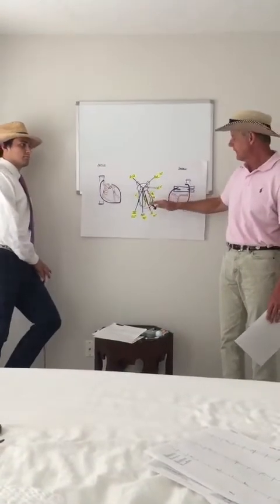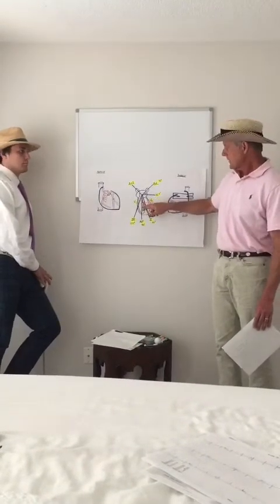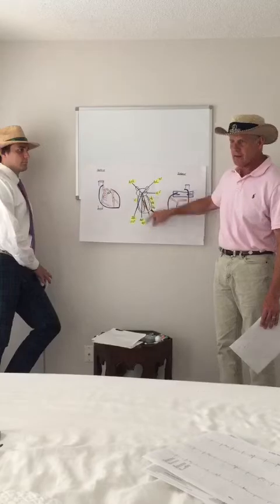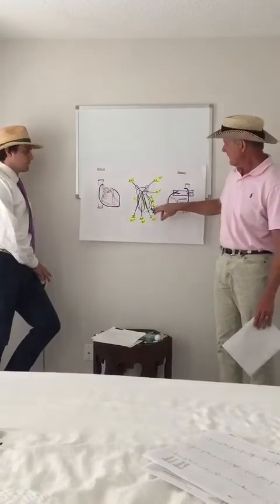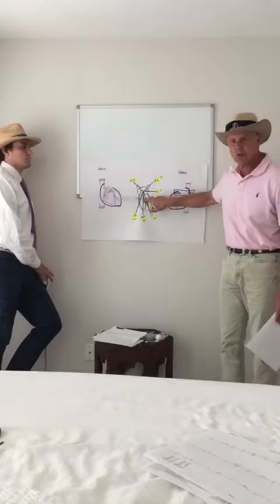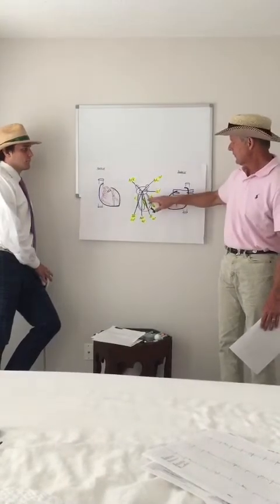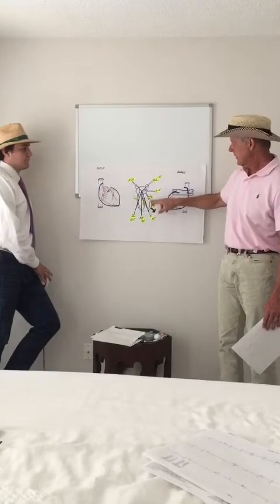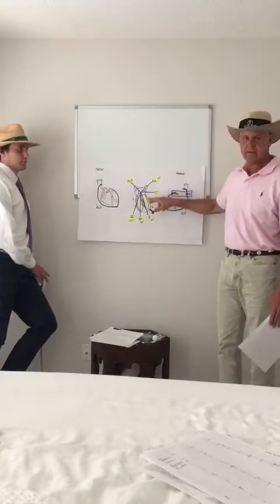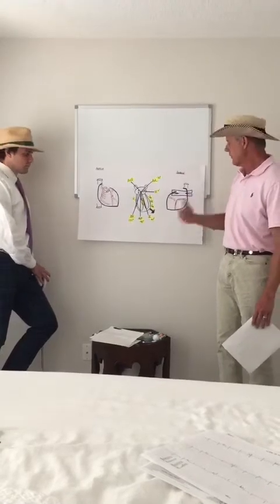We always add the prefix antero when we're talking about the V leads or the chest leads. So when he showed you the EKG with the coved upward convex ST elevation in leads V2 and V3, you knew the patient was having an anteroseptal infarct. If he had an EKG that showed acute ST segment elevation in V4, 5, and V6, you know the patient's having an anterolateral infarct. You don't have to memorize it.